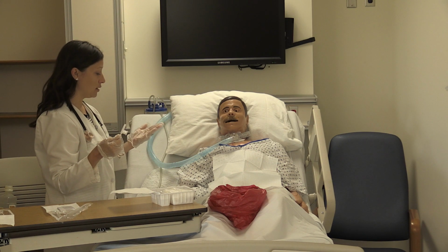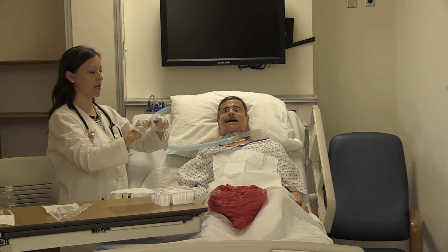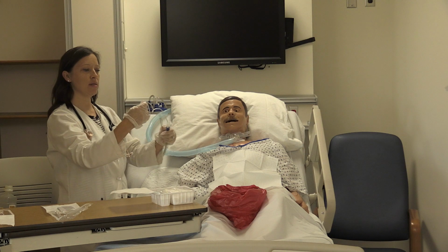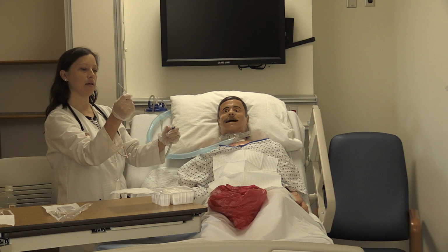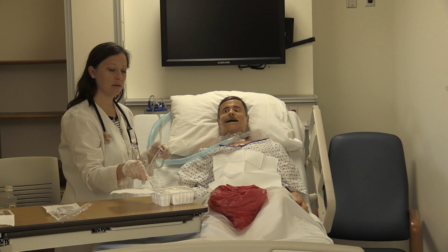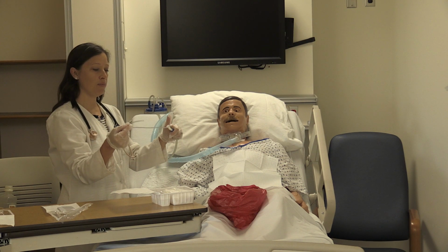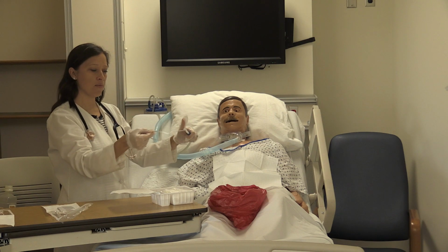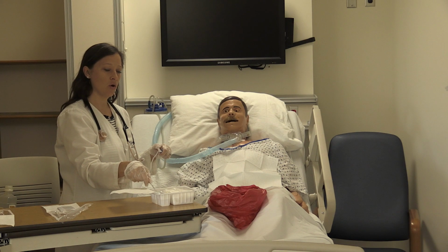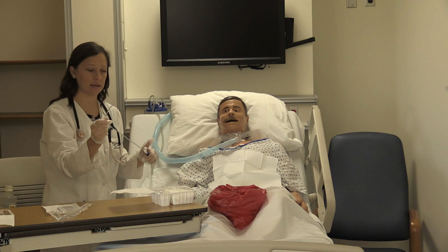So I'm going to go ahead and contaminate my left hand. I'm going to pick up my suction tubing, and I'm going to connect the catheter, making sure not to cross-contaminate either of my hands. As you're doing that, you just gently unwind it, and now we're going to check the suction. So you're going to dip this in and make sure that the suction works, making sure that you're keeping your suction catheter above anything, that it's not going to touch anything and be contaminated. So the suction is working, and then the liquid also lubricates it.